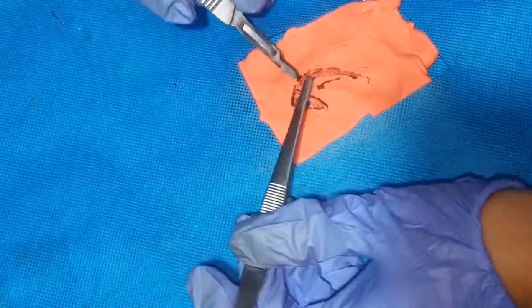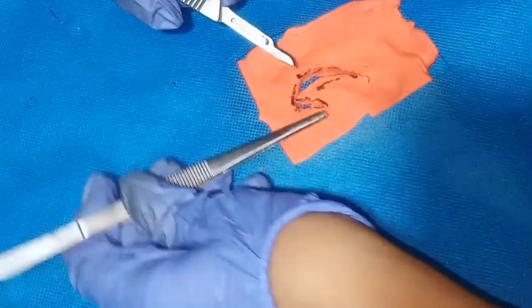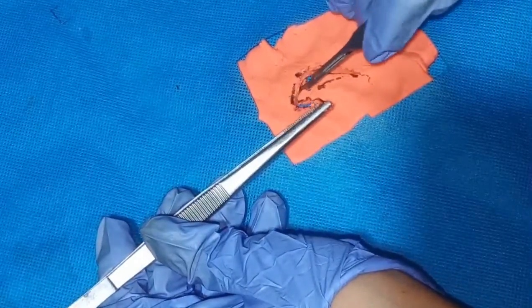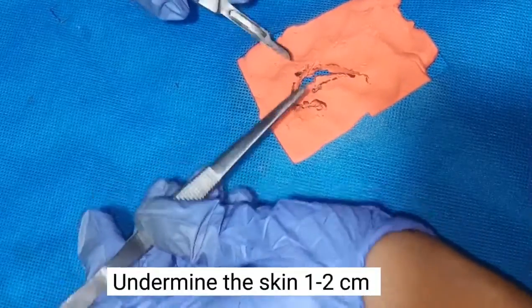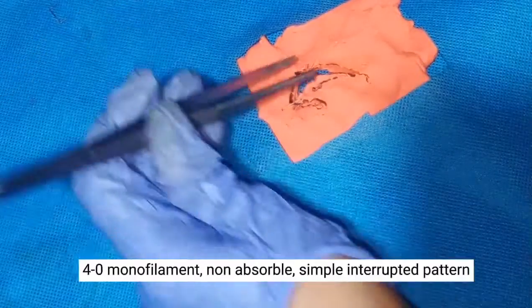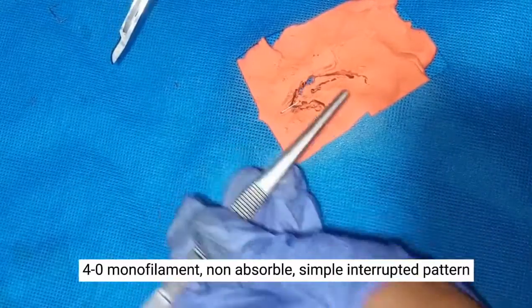Next is to measure and transfer the skin flap to the defect. Flaps can be transposed at an angle greater than 90 degrees, although the flap length will shorten with this greater arc of rotation. Undermine the skin at least 1 to 2 centimeters beyond the defect. A 4-0 monofilament non-absorbable suture material is placed in a simple interrupted pattern to close the skin.